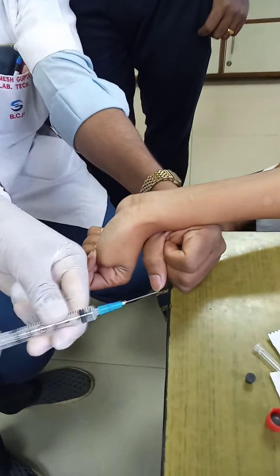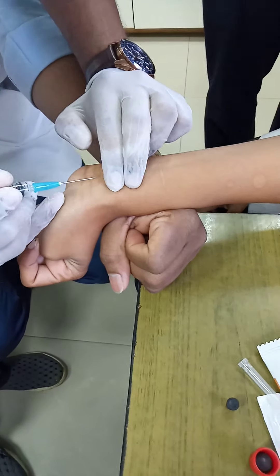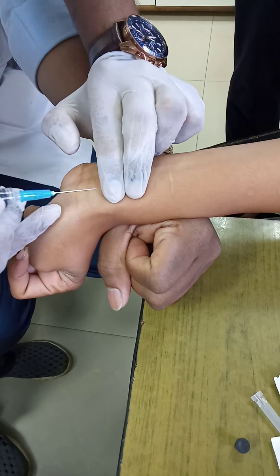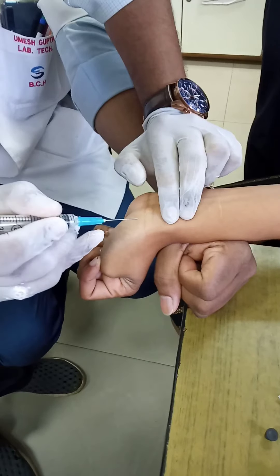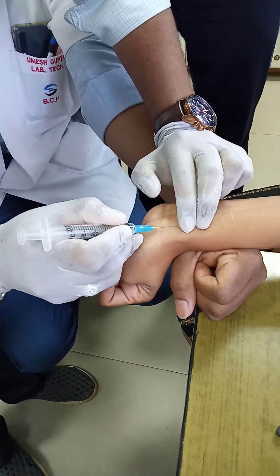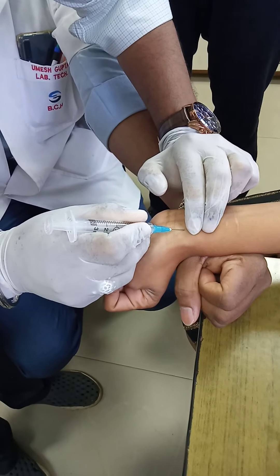Two fingers are placed on the radial artery to check for pulsation before giving the prick at 45 degrees. Gloves are worn. The issue is lack of confidence with ABG collection. The needle should be kept at 45 degrees and inserted between the two fingers — the mistake here is that the prick is given after placing the fingers rather than between them.